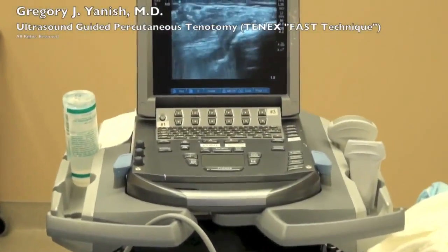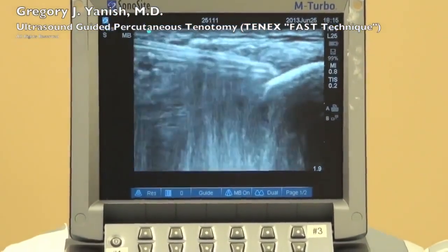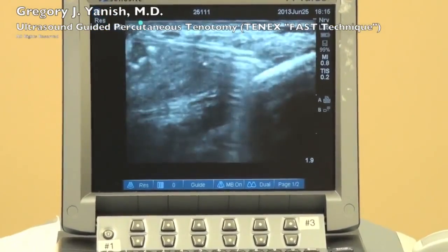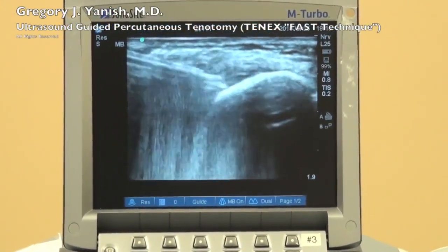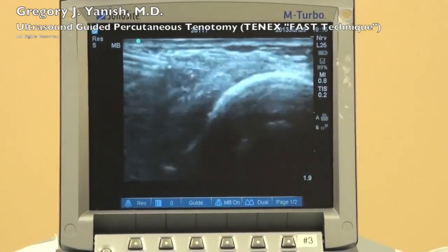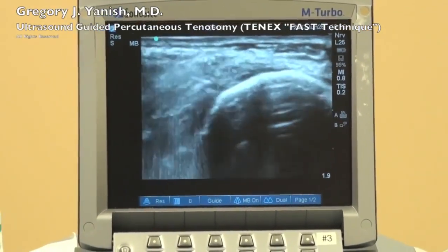You'll see that I'm moving this in and out and can follow this on the screen above under ultrasound. At the same time, I'm pushing a pedal on the floor, and it makes somewhat of a hissing sound as it removes the black portion of the tendon that we saw earlier on ultrasound. You can see that it's removing it in real time.